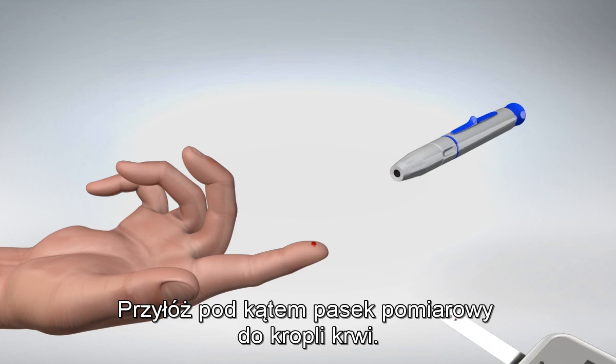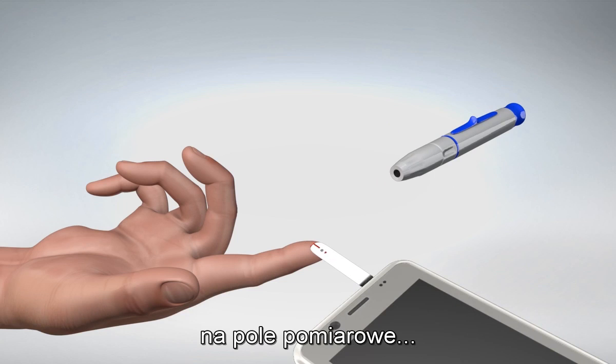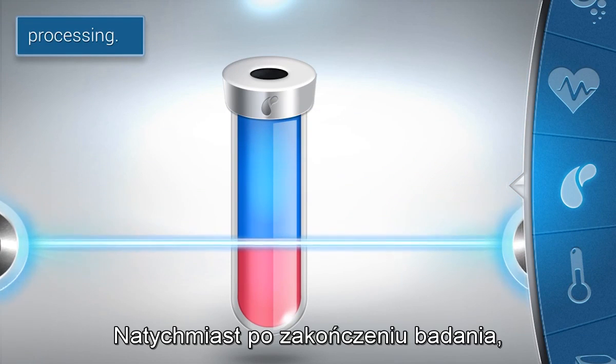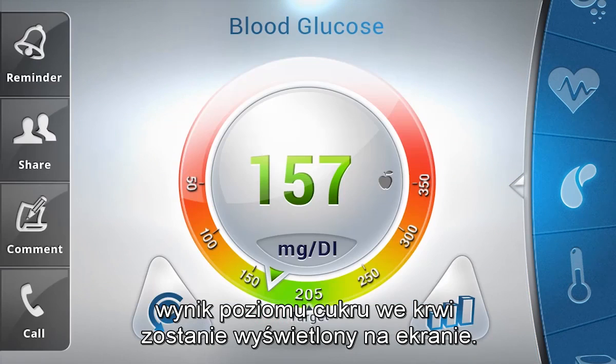Bring the test strip to the blood sample at a slight angle. The test strip acts like a sponge and pulls the sample into the strip through the sample area. As soon as the test is completed, your blood glucose results will be displayed on the screen.